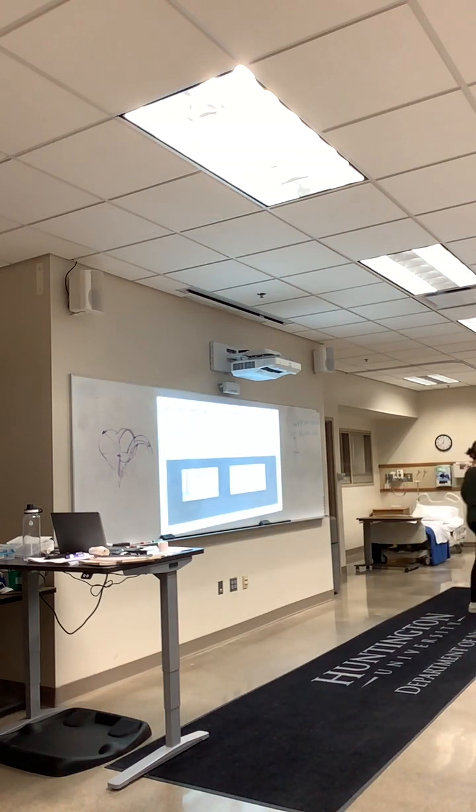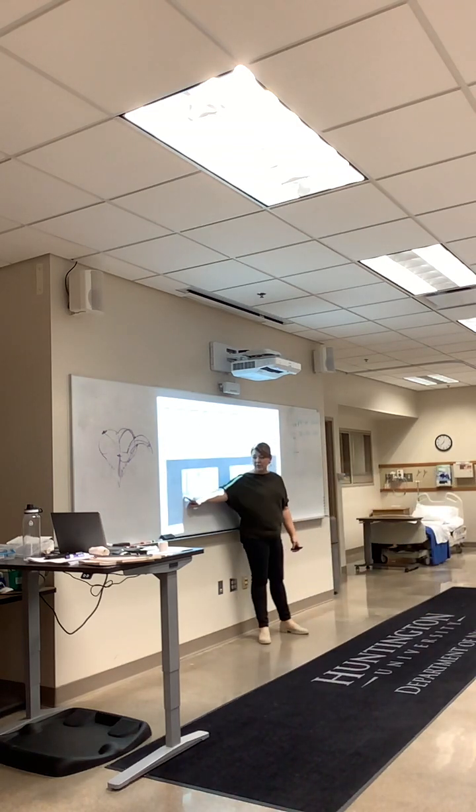What electrolyte causes peaked T waves? Potassium. Okay. When I'm talking peaked T waves, this is what I'm talking about. Here's my P wave, QRS. This is my T wave. P wave, QRS, T wave. That's pretty tall, isn't it? Like, that looks like my QRS wave.